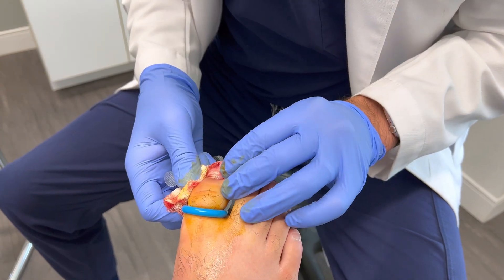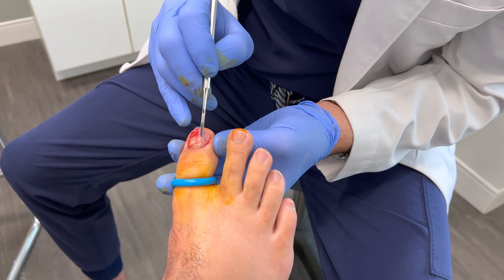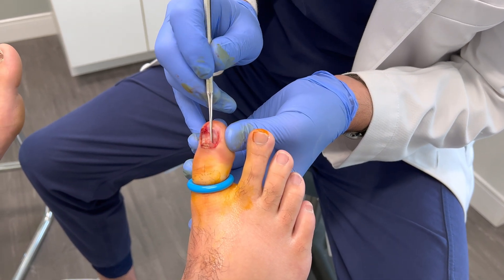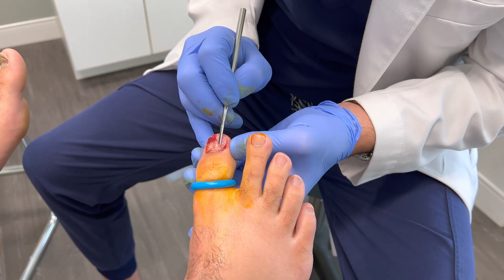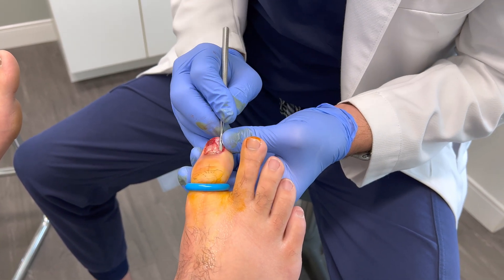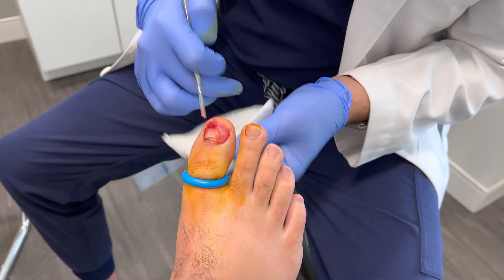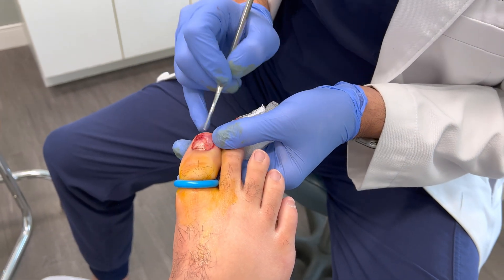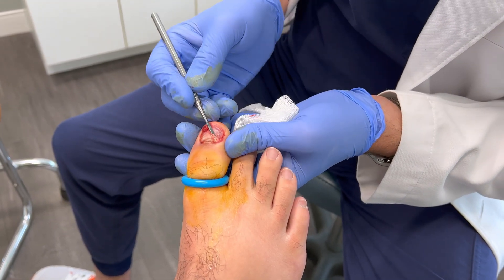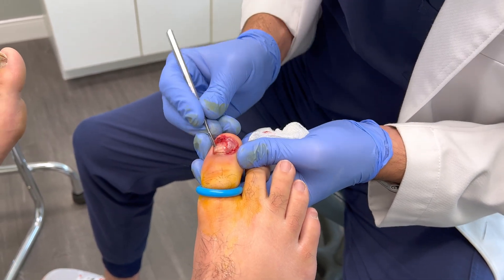Fortunately for this patient, there was no underlying laceration or wound other than just a little bit of expected trauma from removing the toenail itself. Interestingly, there was another layer of very thin toenail here which admittedly did look like some skin, but upon further inspection was noted to be a remnant piece of toenail. This was also gently freed up and successfully removed.